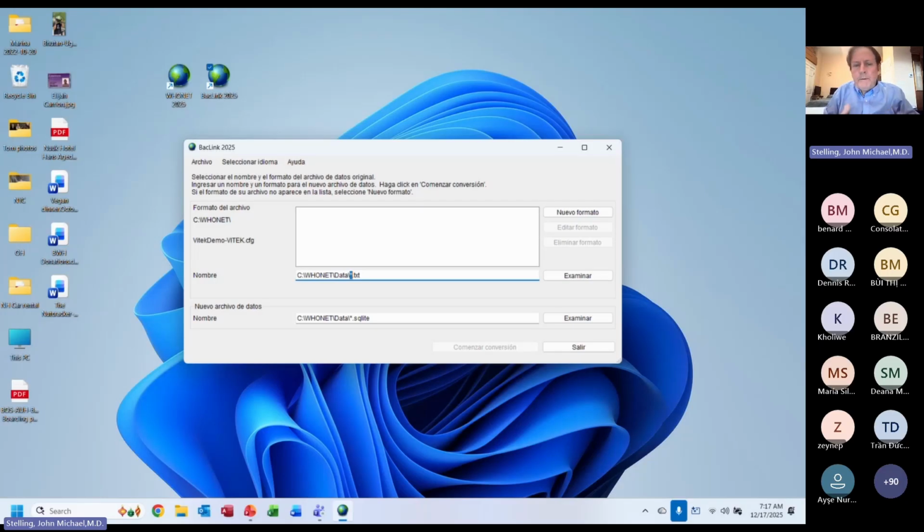But most of the languages, we ran them through Amazon Web Services translation, which is similar to Google Translate. And sometimes the translations are not great. They're good. So it does translate well, but sometimes you will notice a strange translation. For example, the word table in English has a few meanings. I'm sitting here at a table. But then I have a data table. So in different languages, they don't always use the same word.